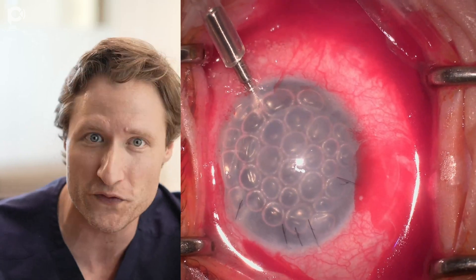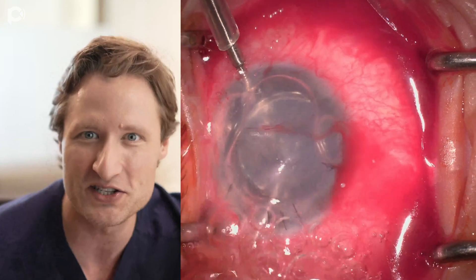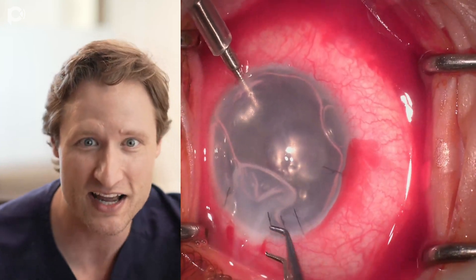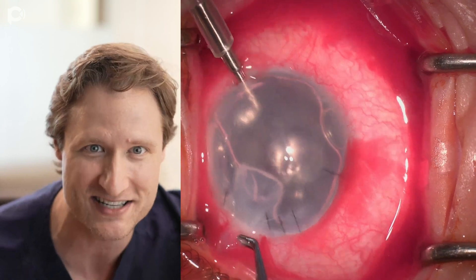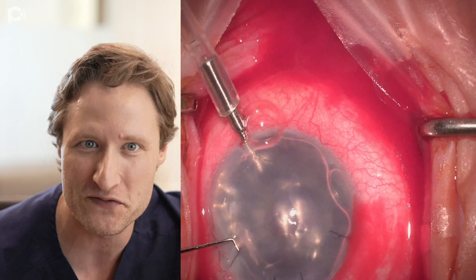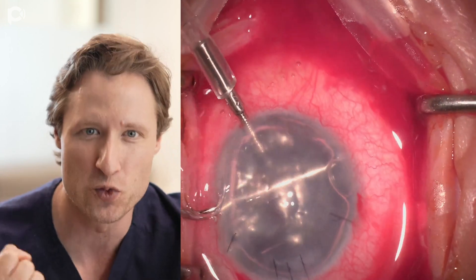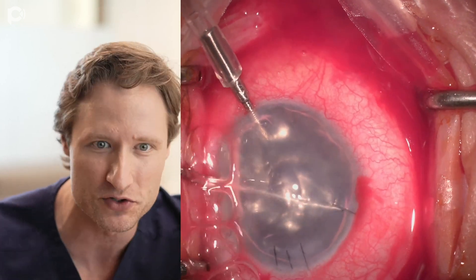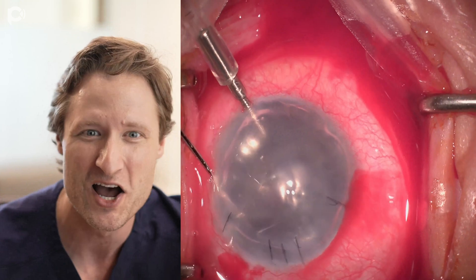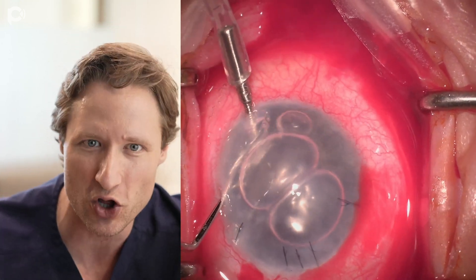Here we're going to remove the old DSEC graft from the eye. I'm using this long inverted Sinskey hook. You'll notice the tip is twice as long as the tips you commonly see on an inverted Sinskey hook, and I love that feature. I really prefer these longer tips because you get so much better grasp and purchase. You're able to stretch out around the eye and circumnavigate the globe without feeling like you have to strain, because you have a longer tip.